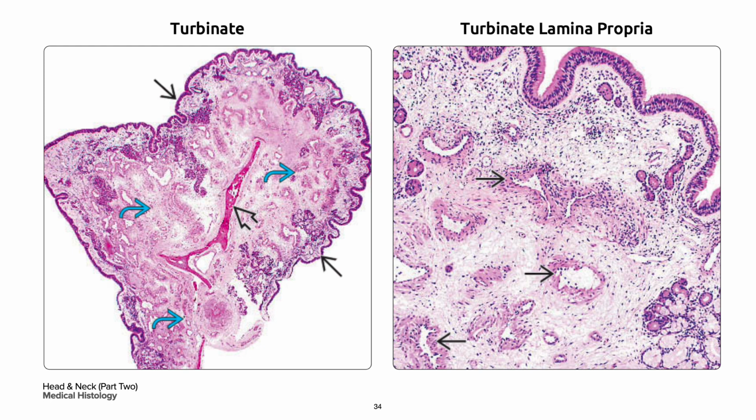On your right is the lamina propria of the nasal mucosa, especially the turbinates and inferior septum. It contains a network of variably sized venous sinuses which have a thick muscular wall, pointed out in a black single arrow. These sinuses can rapidly constrict or dilate in response to various stimuli and histologically resemble erectile tissue.